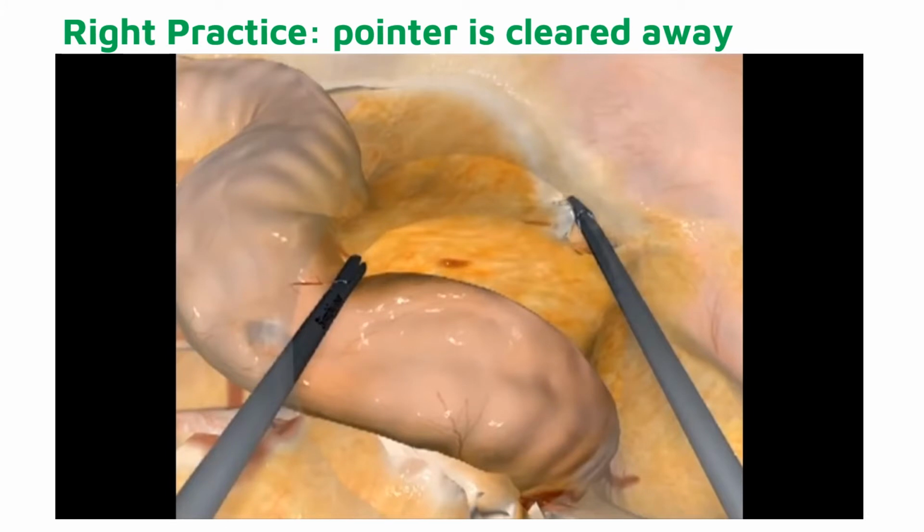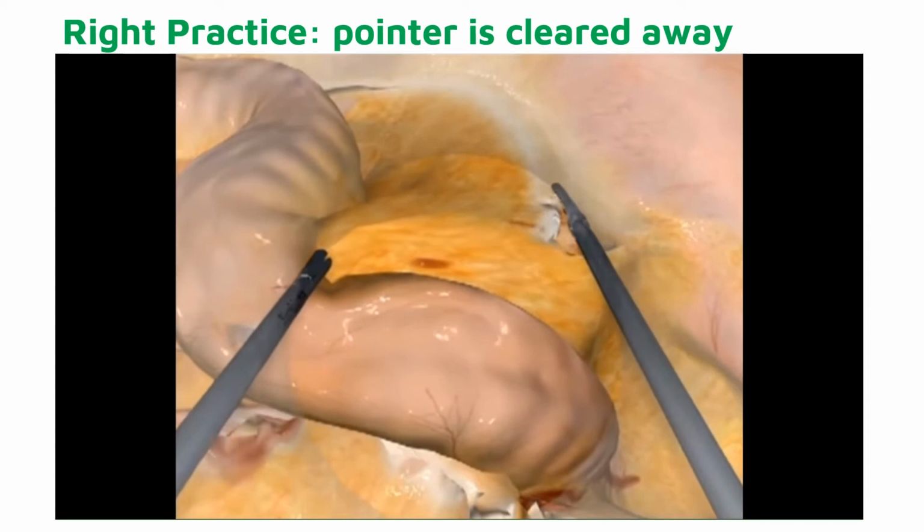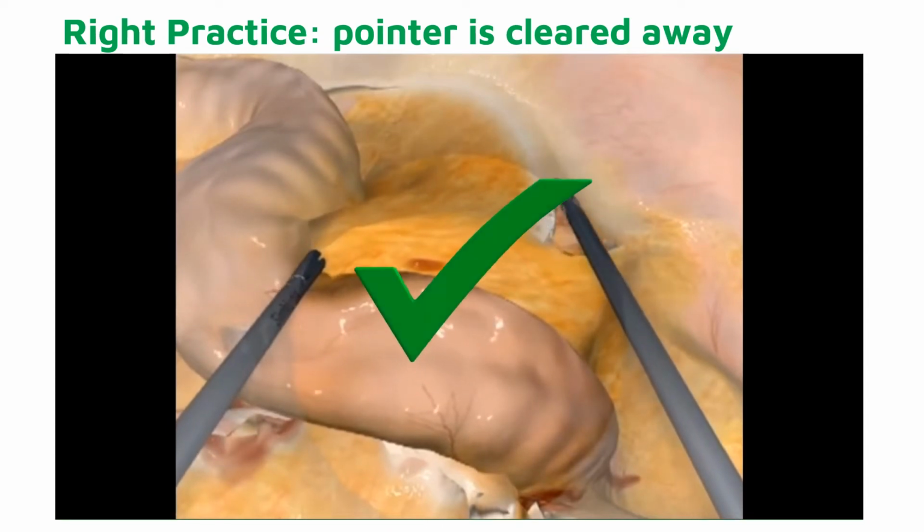Now an example of a right practice. As you can see, the pointer is cleared away. Yes, that is a good trajectory. Keep cutting there.